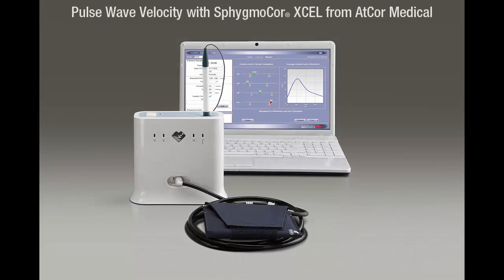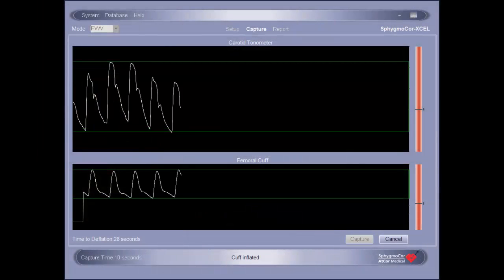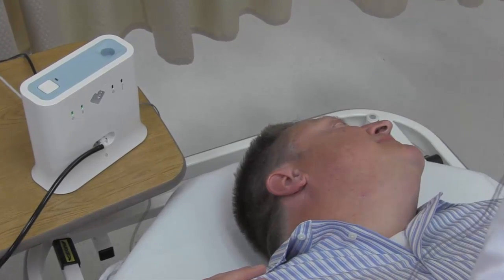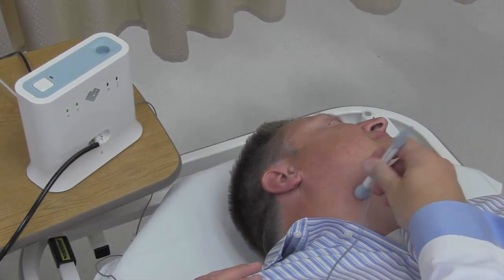Welcome to the SphygmoCor XCEL Pulse Wave Velocity tutorial. This video will familiarize you with the operation of the SphygmoCor XCEL system and how to properly conduct a pulse wave velocity assessment. This tutorial does not cover system setup. If assistance with system setup is needed, please consult your operator's manual.